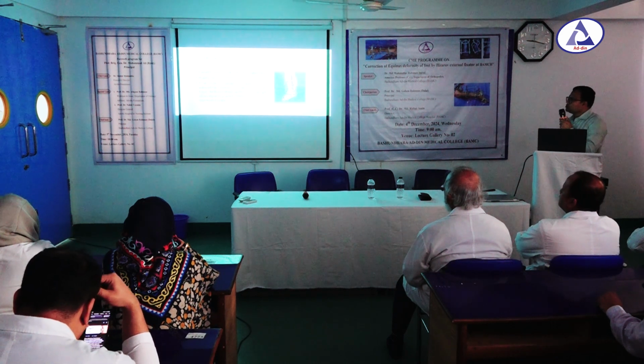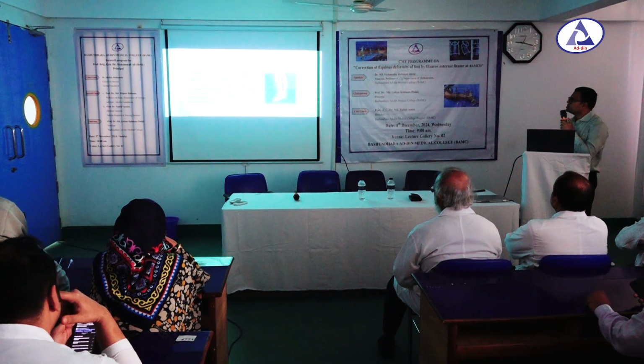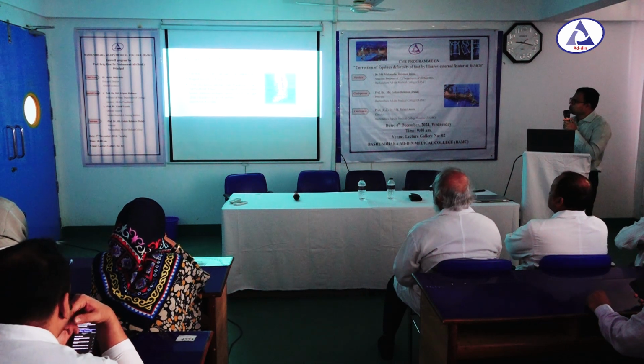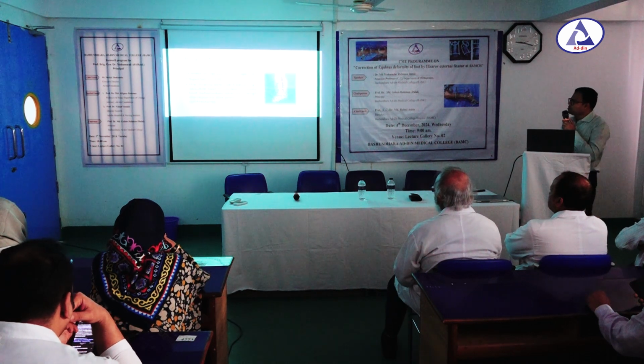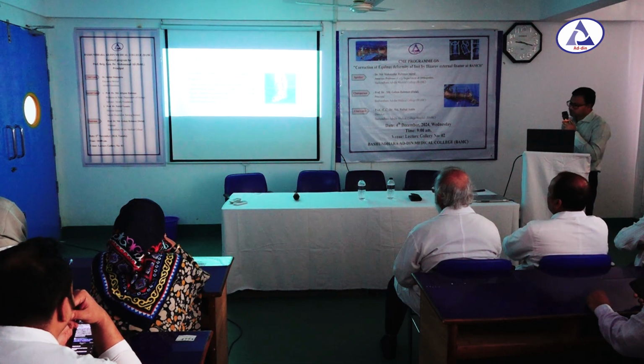And what are the indications of using Ilizarov for the correction of equinus deformity? One is failed conservative management, rigid form of equinus. The Ilizarov external fixator is a valuable tool to correct complex foot deformities with limb length discrepancy and joint contracture.